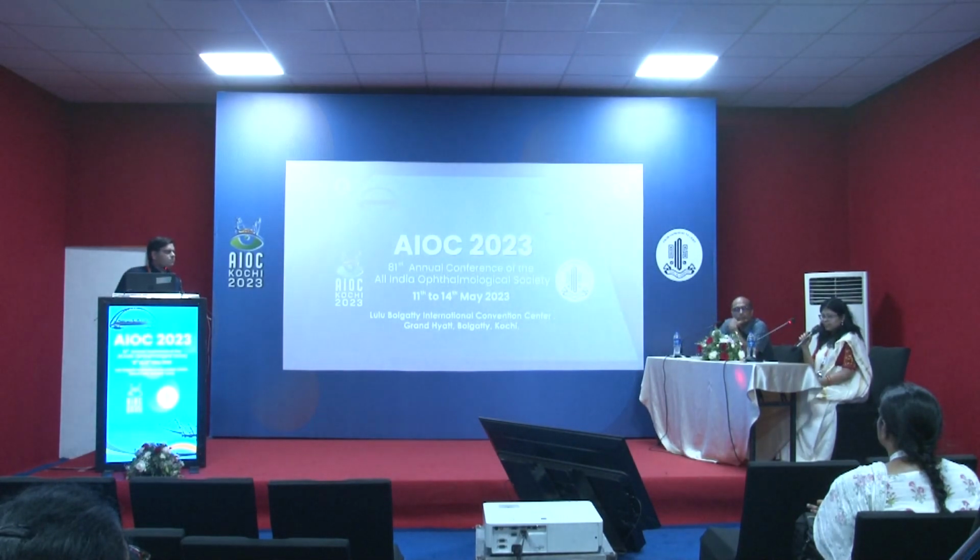Yes, one important thing is that these days diffusion weighted imaging helps us a lot in differentiating malignancy or neoplasm from any other benign lesion or benign condition. So that is very important in our practice. Sir, would you like to add something?